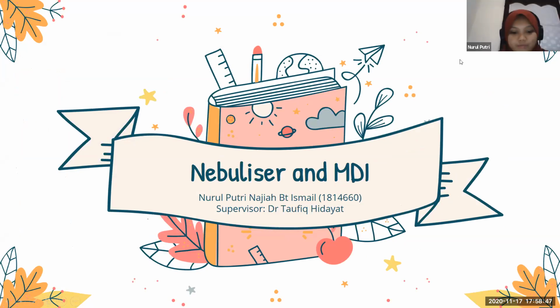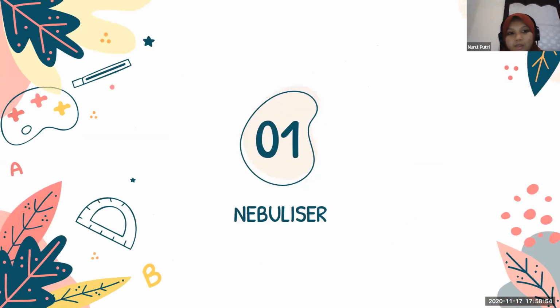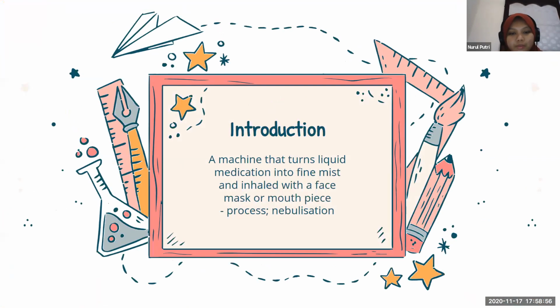I hope everyone can see this and hear my voice. Okay, so I will be presenting on nebulizer and MDI. Let's start with nebulizer. A nebulizer is a machine that turns liquid medication into a fine mist that is inhaled with a face mask or a mouthpiece. The process of using this machine is called nebulization.